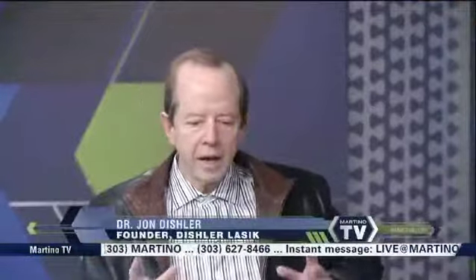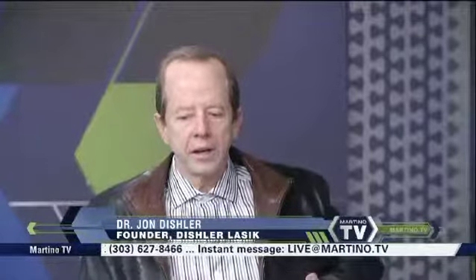Yes. Explain it, because to me this is exciting, and maybe we can show on the eye what it looks like. But you know, this is real news. This is really exciting. The FDA just last Friday granted approval to this company I'm working with, Revision Optics, one of their investigators, to start implanting this new special contact lens. It's very, very tiny. It goes in just under the surface of the cornea of the eye.